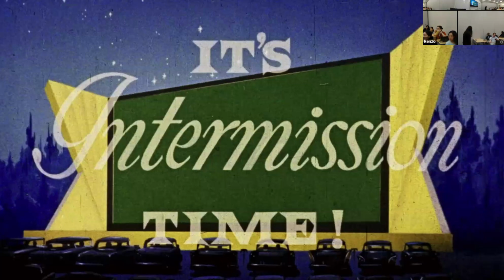From online, someone else asks: does CS suffer its own artifacts? I saw that it has ringing. It does, yeah, absolutely. There are different forms of compressed sensing. The one that we have is technically a Cartesian readout that is using compressed sensing. And that one in particular doesn't have a lot of ability to fight big motion if it happens during the scan. The main way that we're trying to compete with things like ringing from motion artifacts is to shorten the scan.